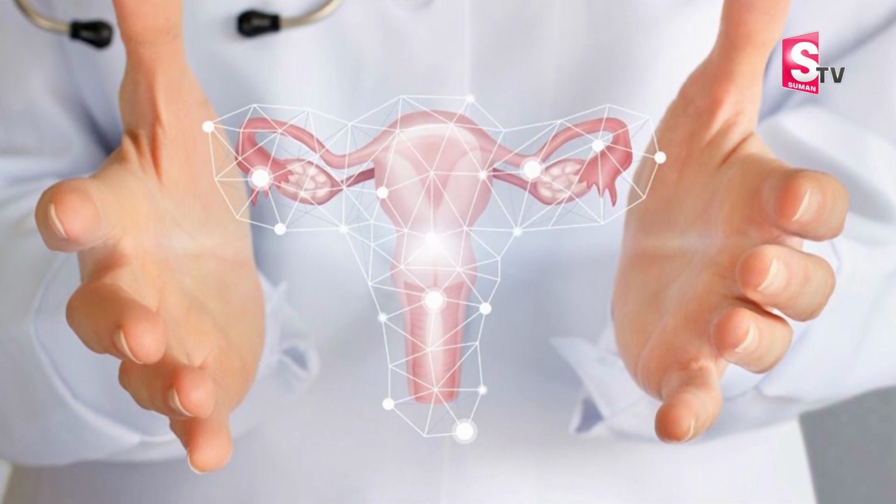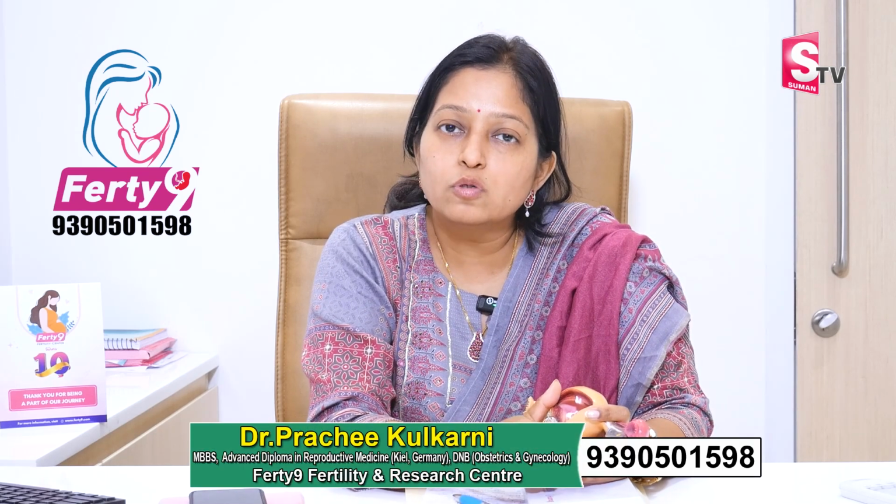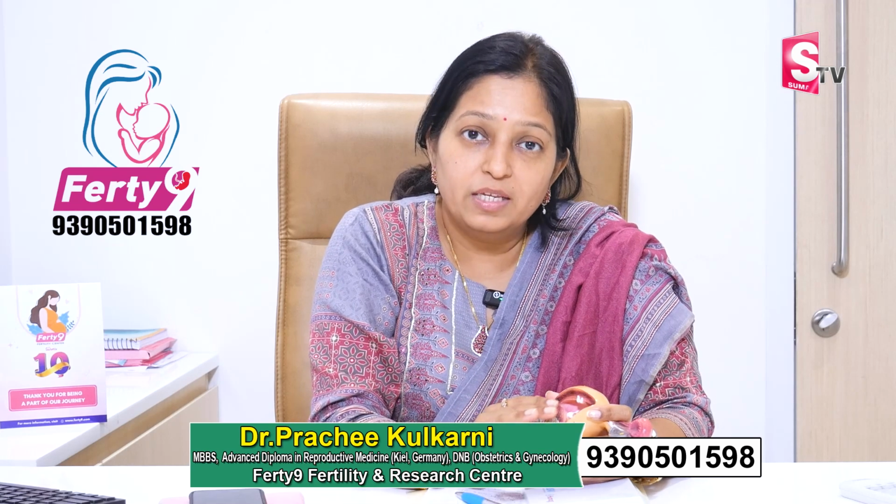What could be the indications in fertility is we need to see inside of the uterine cavity to rule out any minor adhesions, any problems with the lining of the uterus, any polyps in the uterus which is diagnosed on sonography, or any submucous fibroid, or any septum of the uterus which may require correction. So it can be diagnostic hysteroscopy or it can be an operative hysteroscopy. Usually we perform operative hysteroscopy more often, because most of these things are diagnosed on ultrasonography.